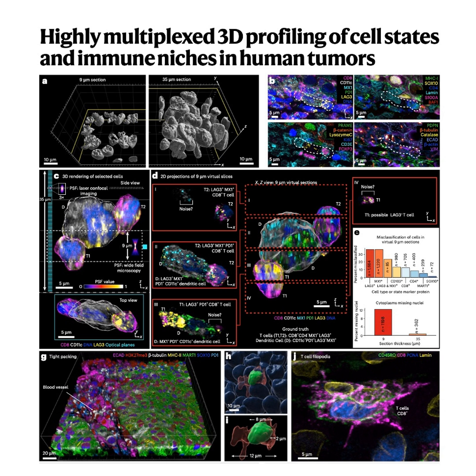So just to recap this first part before we dive into the discoveries, we've established that decades of 2D tissue analysis, the standard of care, suffered from a massive, previously underappreciated bias. Because of the thin slicing, about 95% of cells were fragmented. Right. Leading to potentially huge errors in identifying cells, missing important protein signals, especially those localized ones, and misinterpreting proximity as interaction due to overlap.